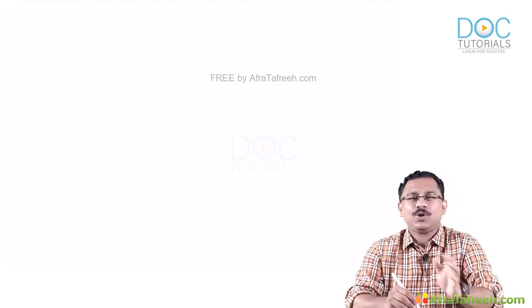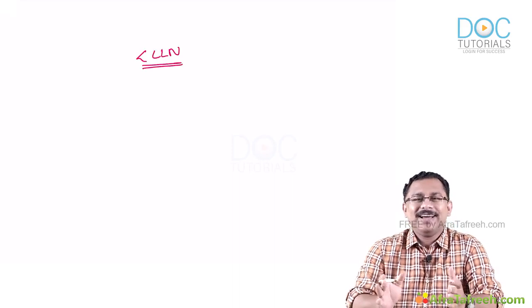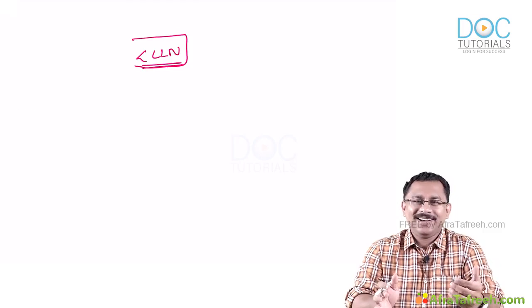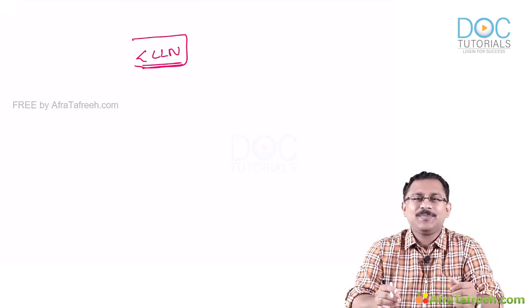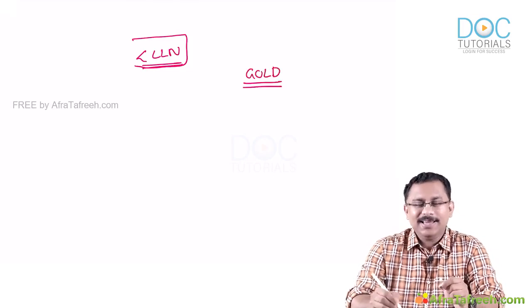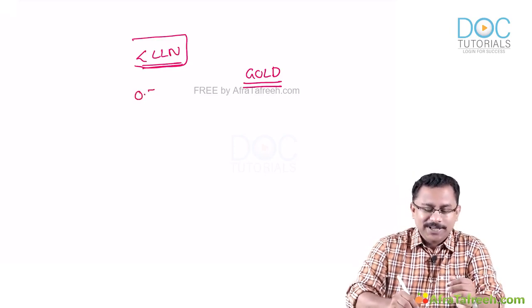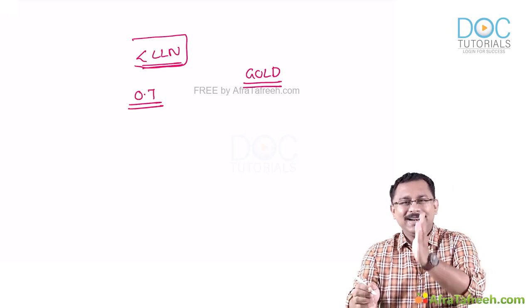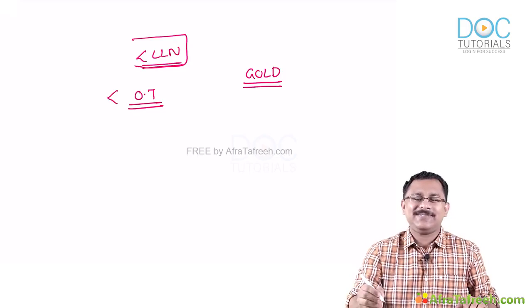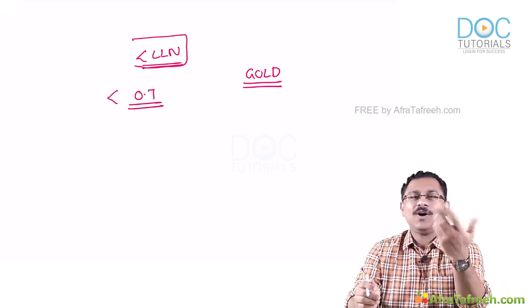As per the American Thoracic Society, they have a set of guidelines based on age and sex, so below the lower limit of normal is taken to be the criteria. But as per GOLD, which we have discussed in COPD, the Global Initiative for Obstructive Lung Diseases, the value taken is 0.7. So in obstructive lung diseases, the FEV1 to FVC ratio is less than 0.7, whereas in restrictive lung diseases, the value is normal or increased.